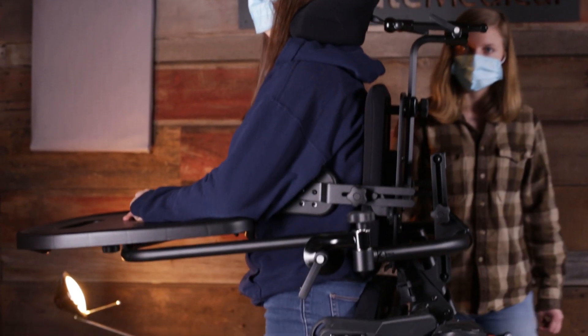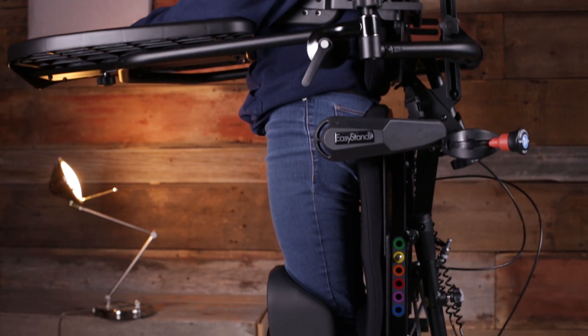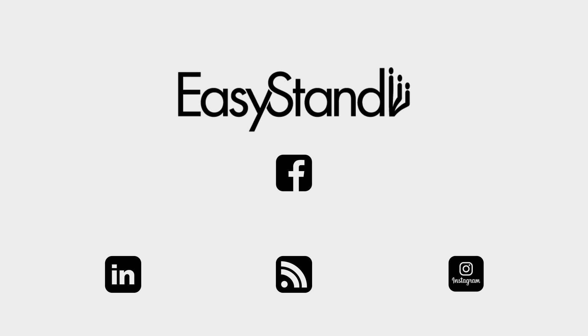The positioning possibilities of the Bantam medium make long-term standing a reality for larger children or small adults with complex positioning needs. For more information about the Bantam medium and to schedule your free product demonstration, go to EasyStand.com.